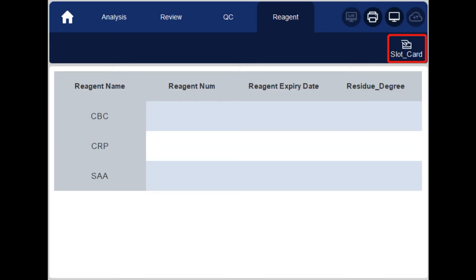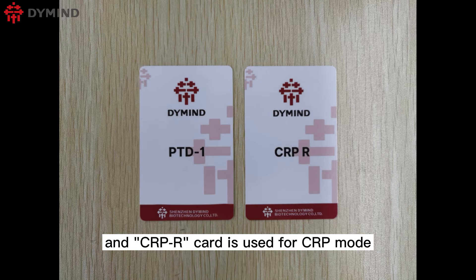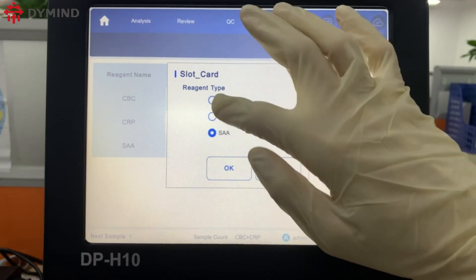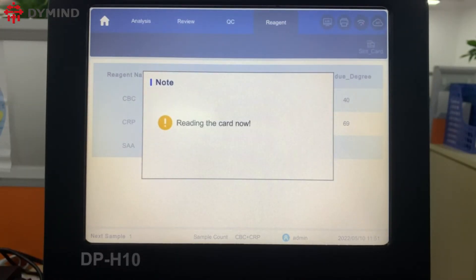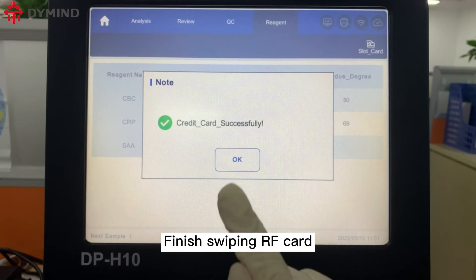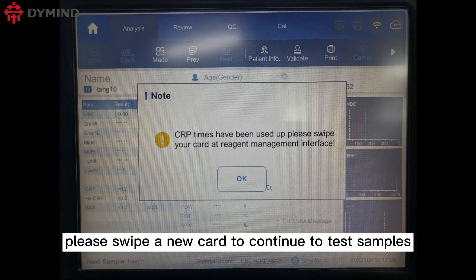Click Reagent, then Slot Card, to begin swiping the RF card. Please note that the PTD1 card is used for CBC mode and the CRPR card is used for CRP mode. Place the RF card on the scanning area for at least 5 seconds to finish swiping. The device can perform 50 samples of testing. If the number of samples reaches 50, please swipe a new card to continue testing.